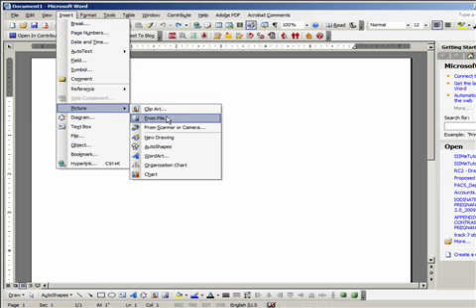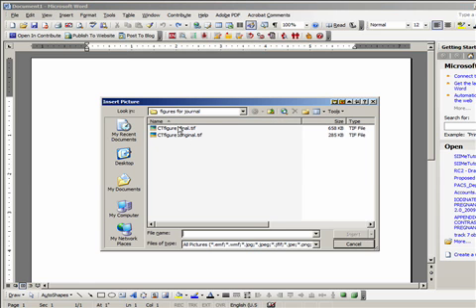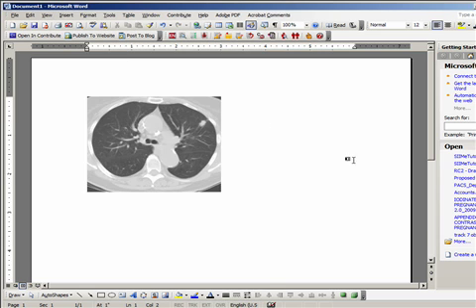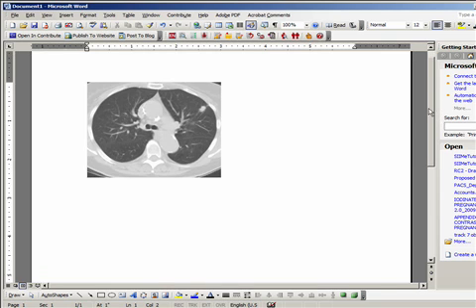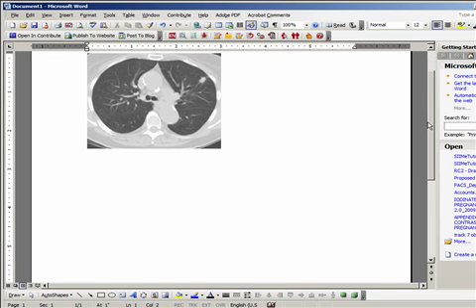Go to the Insert tab, Picture from File, and now we will include the final image that we produced. The figure is 3 inches in width and approximately 2.5 inches in height, and the appearance of the image looks reasonable.